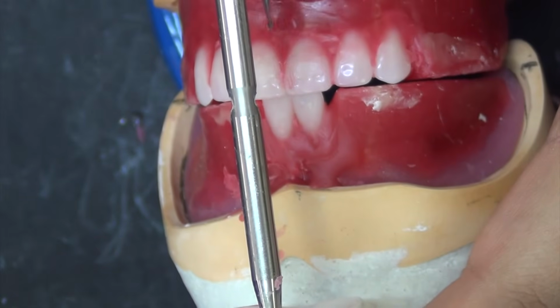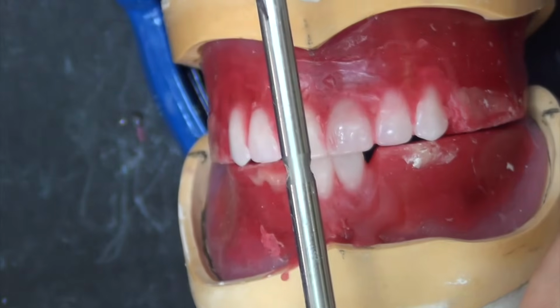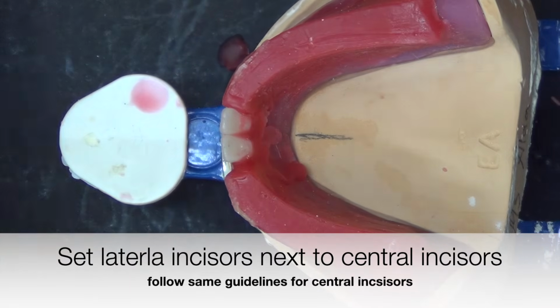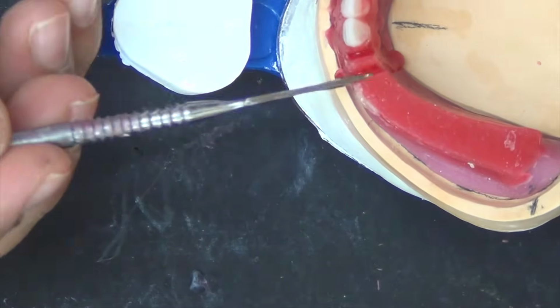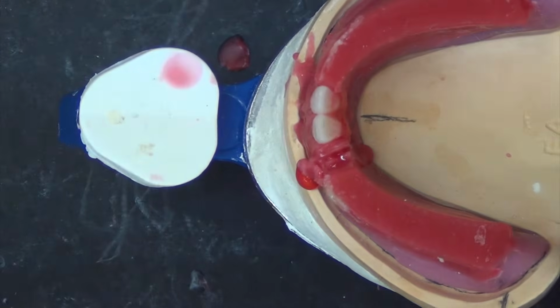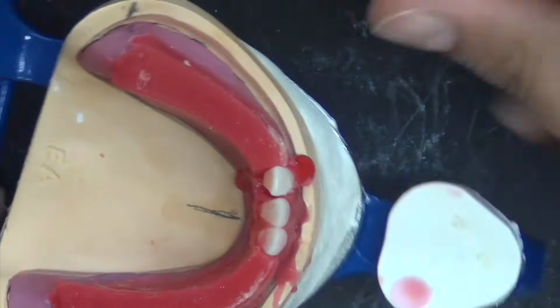The lower midline should be coincident with the upper midline. Position the lateral incisors next to the central incisors, with the long axis directed toward the residual ridge. The incisal edge should be at the height of the occlusion rim, and continue the 1 to 2 mm horizontal overlap between the maxillary and the mandibular anterior teeth.